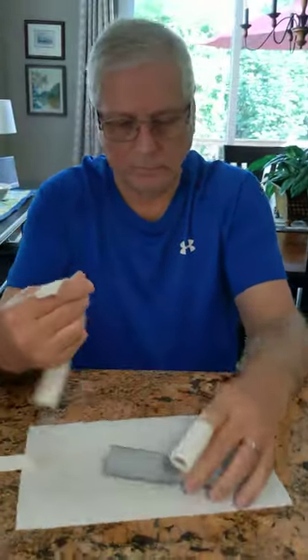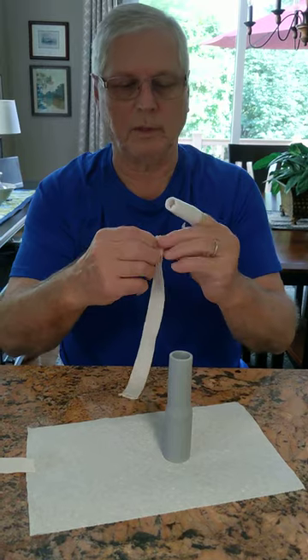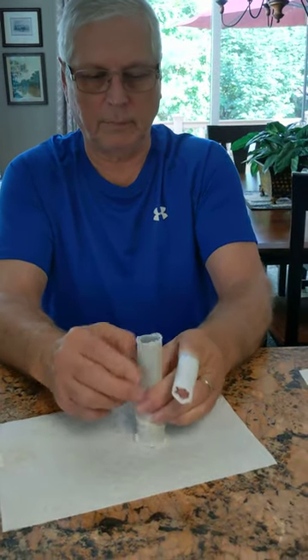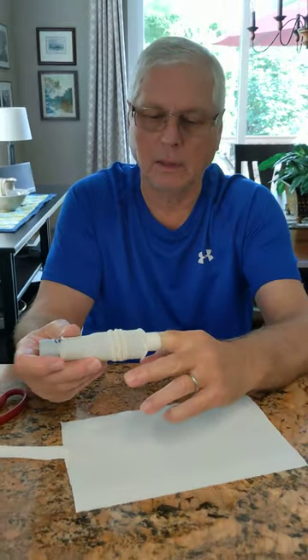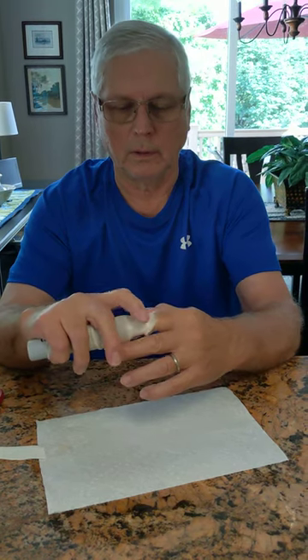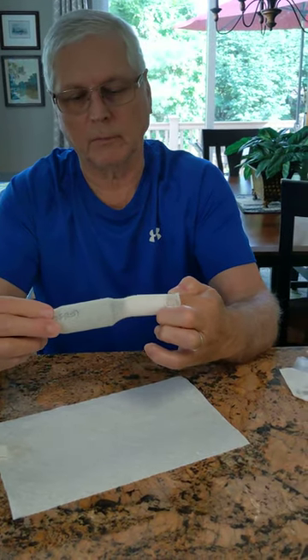What you do is you take this and you feed it over the tube. Now this is what they did at the hospital, but they had a real nice stainless steel cage deal. You put this over the top, you put your finger inside to a point where it covers the wound. You put this on and hold it with your other fingers, and as you pull it out it covers it.